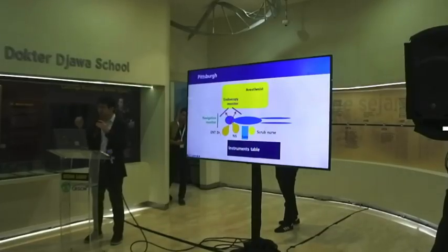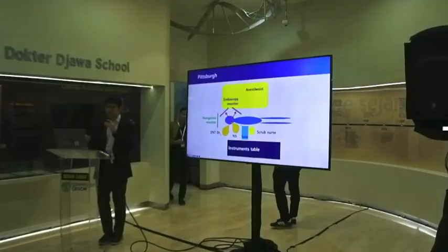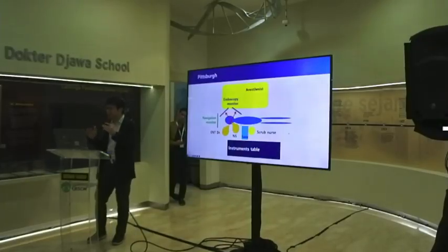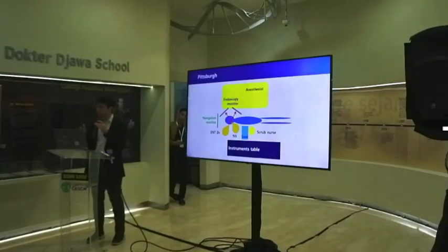Each doctor holds the endoscope for the neurosurgeon, and the scrub nurse sits on the right side of the neurosurgeon. As Professor Kim told us yesterday, this is the linear alignment, but it feels a little awkward and somewhat difficult to hand over instruments from the scrub nurse.